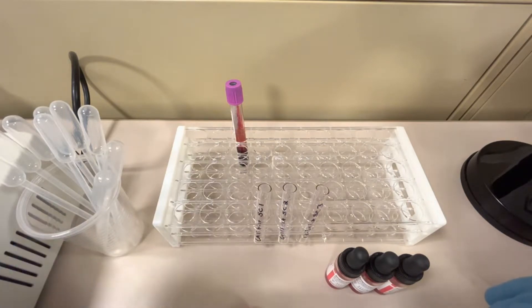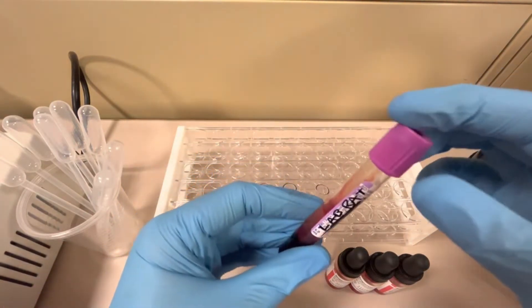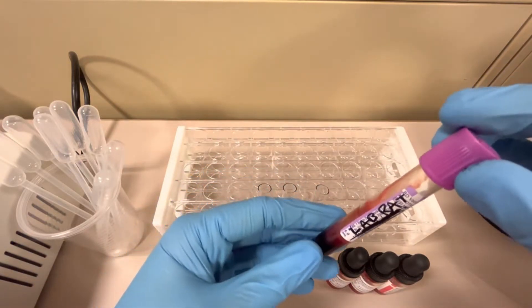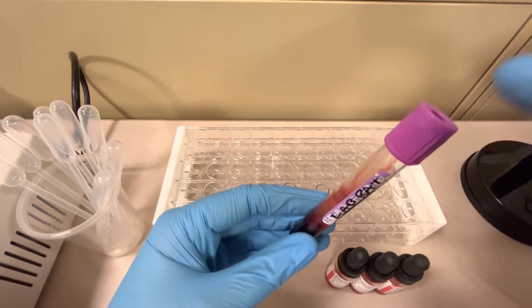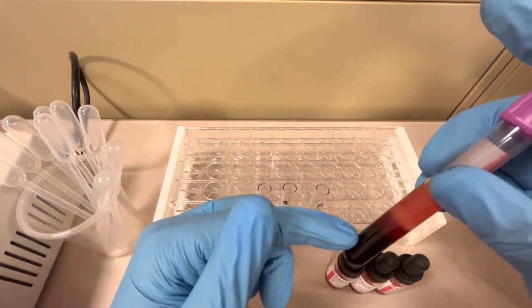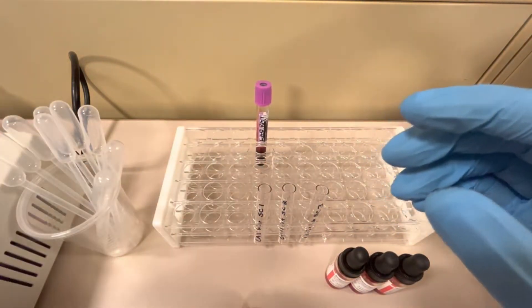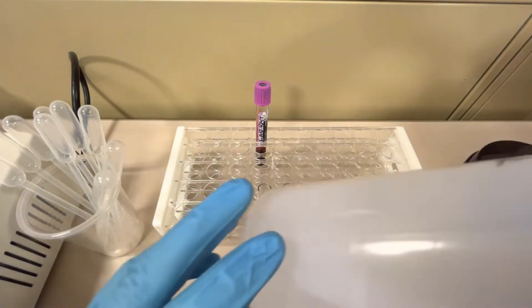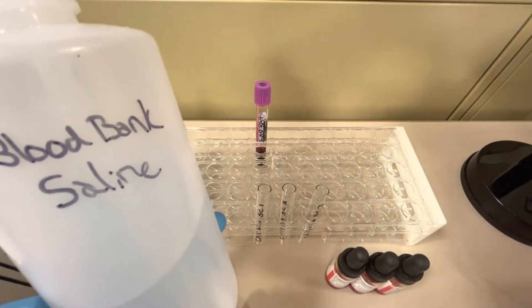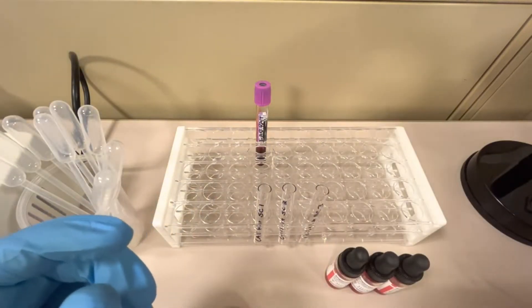First, I have the correctly identified patient sample labeled 'Lab Rat' — this is actually a phlebotomy student's sample I'm using. It has to be an EDTA tube, so either a lavender or a pink top tube, and it has to be spun down so you can see the patient's plasma and red blood cells. We also need disposable pipettes and blood bank saline. It has to be saline, not water, because water will lyse the red blood cells.